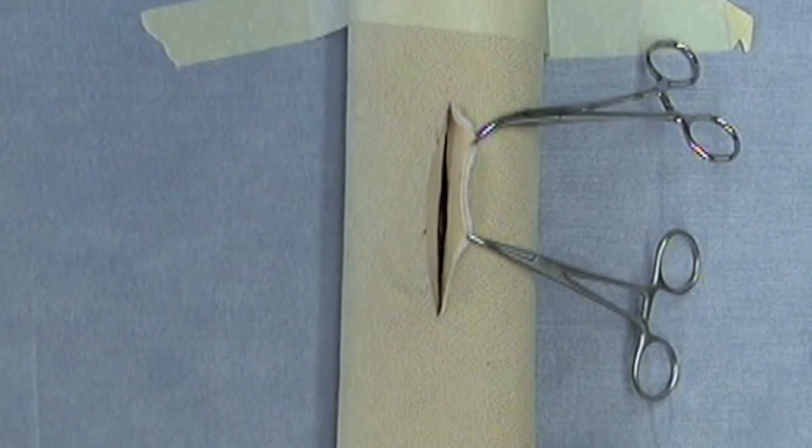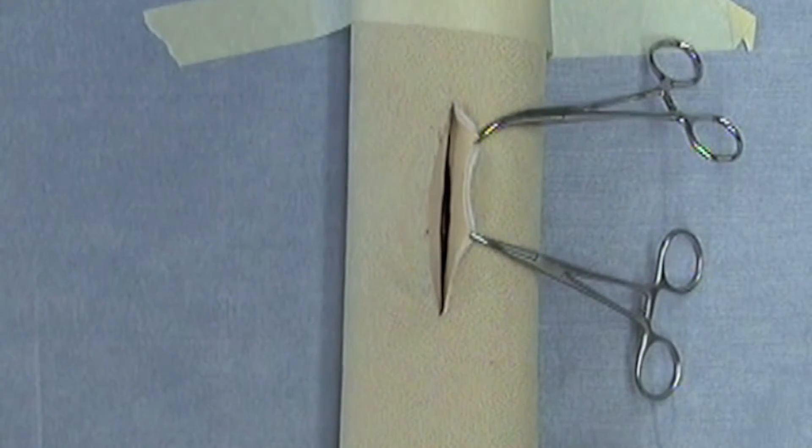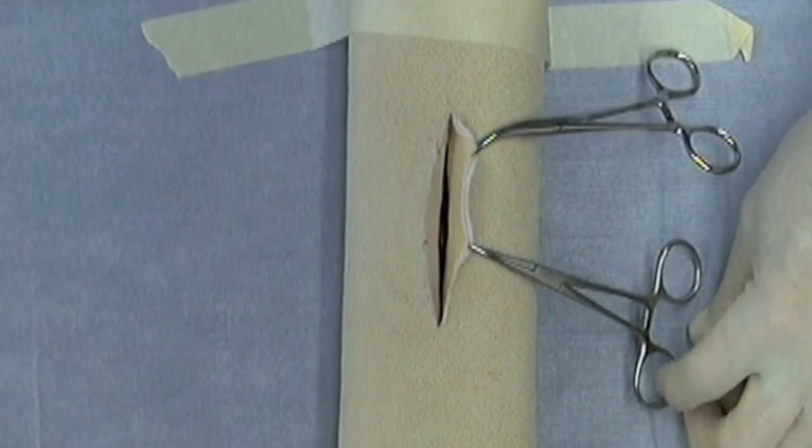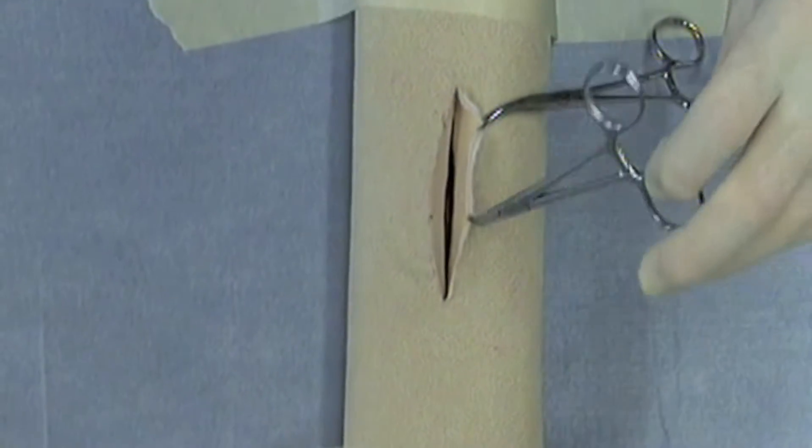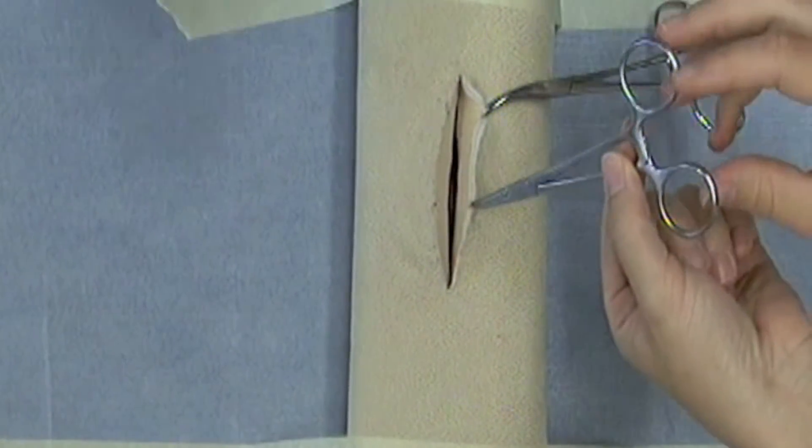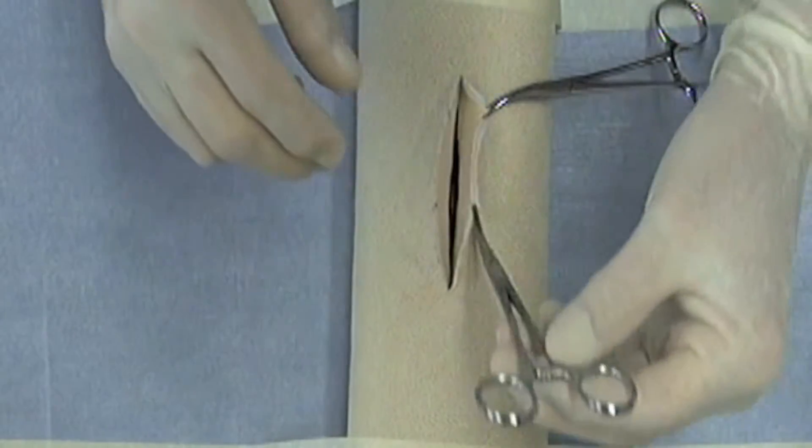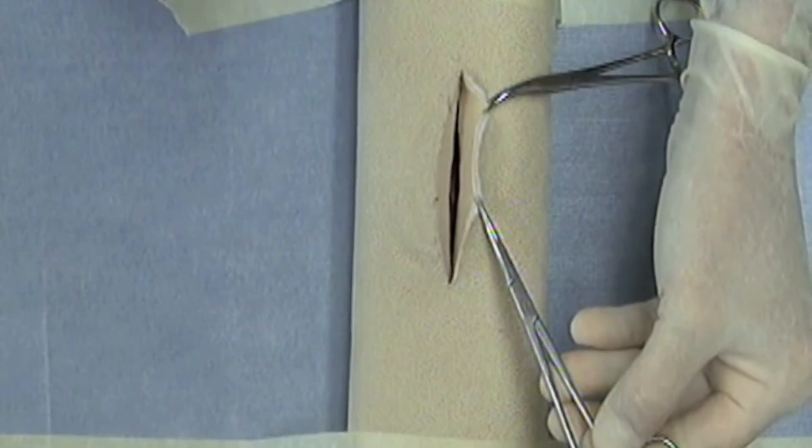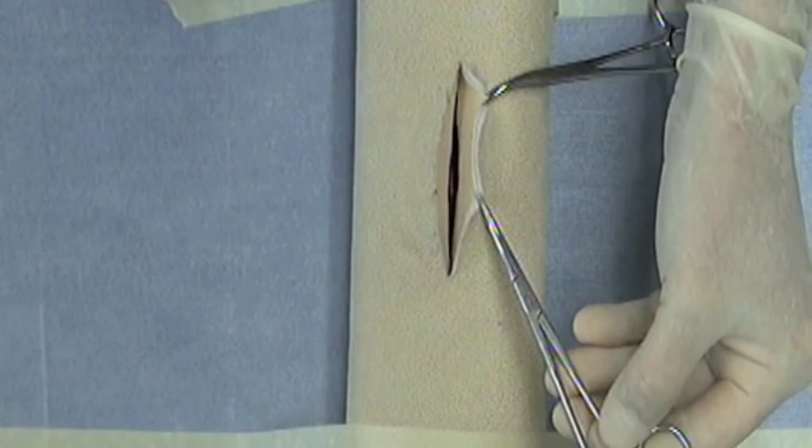Now to do this properly certainly requires an assistant surgeon and so I will have my trusty assistant come and help. One of the reasons that I applied the Kelly forceps in that manner is that when you tie around a hemostatic forceps, you need to have the tips of the instrument presented to the surgeon.